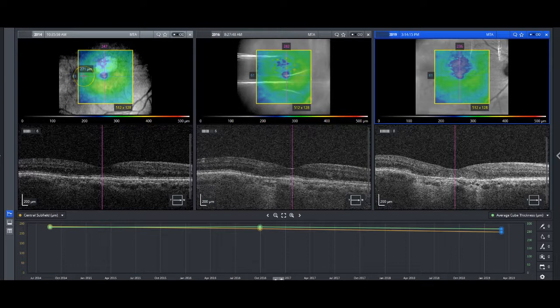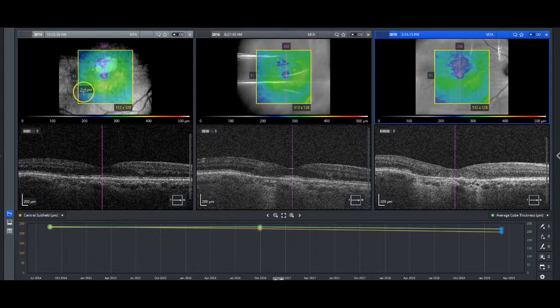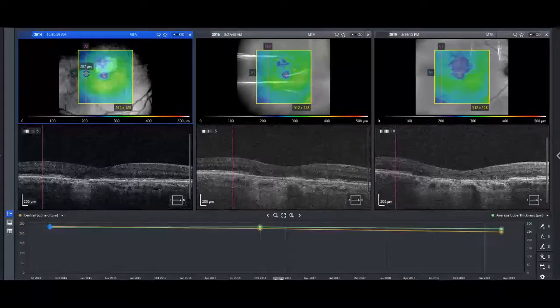This is a patient with age-related macular degeneration and geographic atrophy, and what you really want to do is watch. I'm going to scroll through. You really want to be watching the ellipsoid zone and seeing what happens to it, because that's one of the most important areas to watch when you're assessing for geographic atrophy. Let's scroll through there.